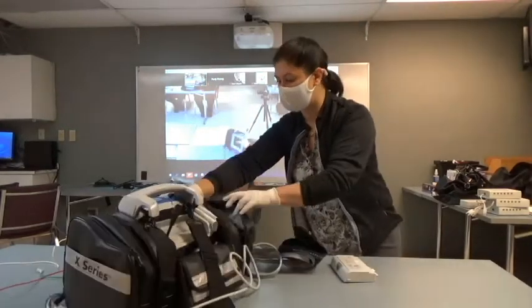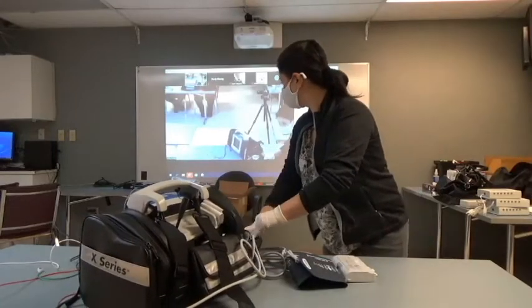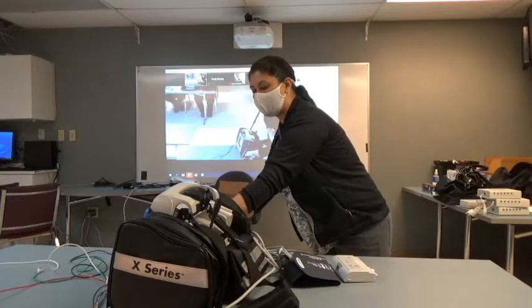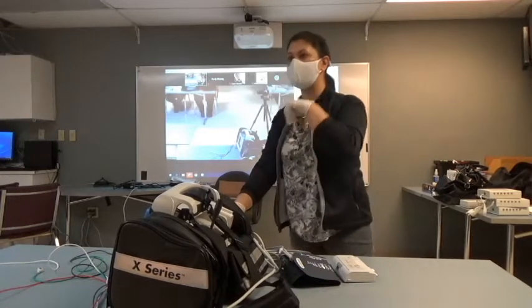Moving down from there, you guys are gonna find capnography. It's the little door that swings from side to side.